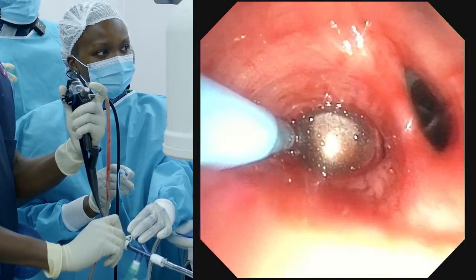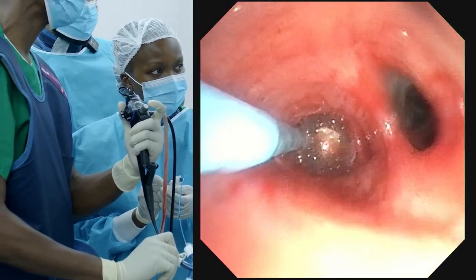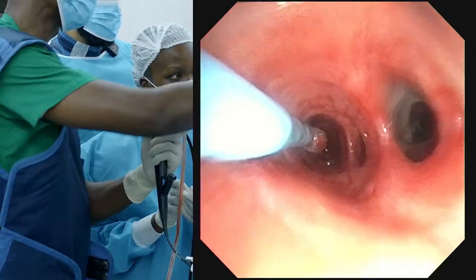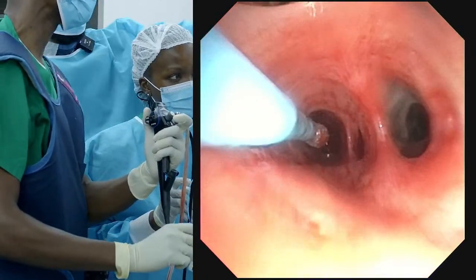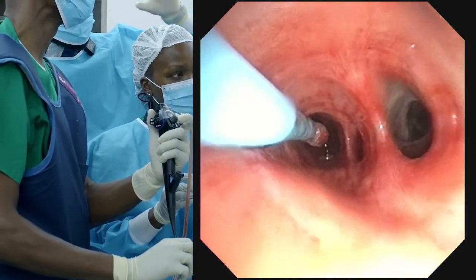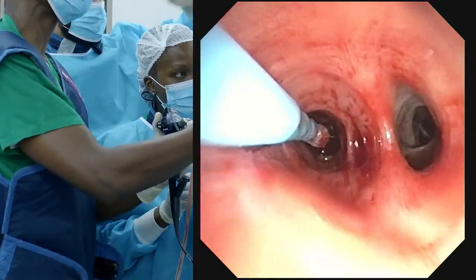Good. Deflate your balloon a bit. Watch for about 2 seconds. There. Yeah, this is right. And that's why you see the blocker placement is very important. That's why we're very particular on where we place it and how we place it. Now I'm getting the gist of it. Let me go for another.